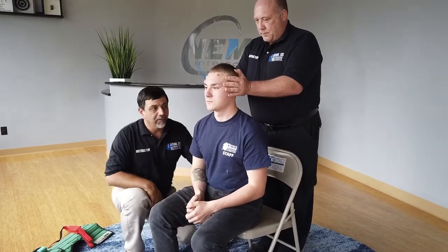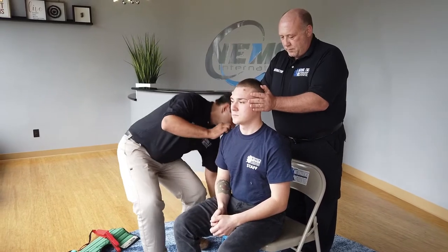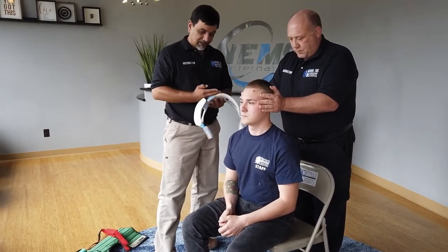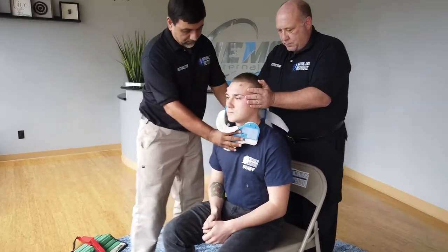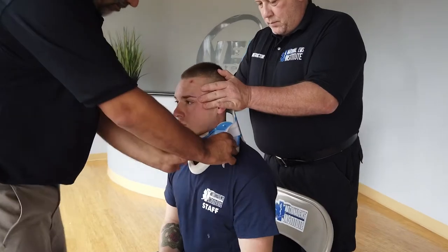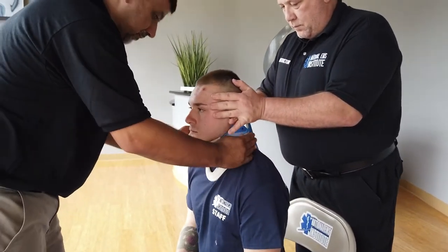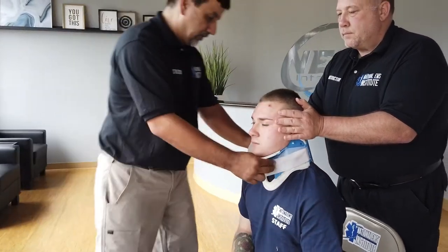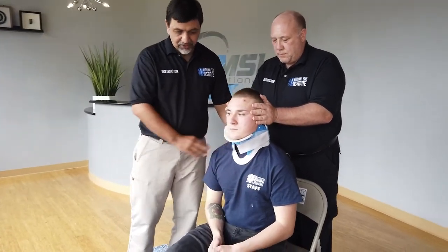At this time I am going to measure and apply a collar. Properly measuring the collar and fitting it to the patient's neck to make sure there is not hyperextension or too loose a fitting. Can you open your mouth? Excellent. Good. Now you notice the collar is in position.